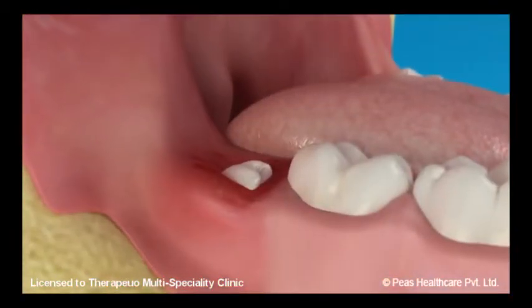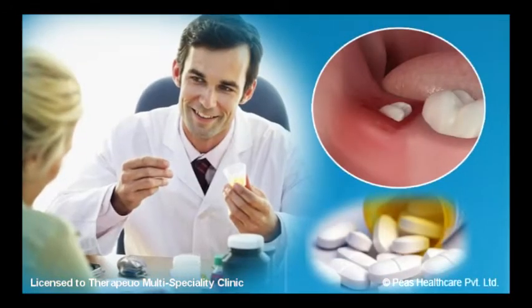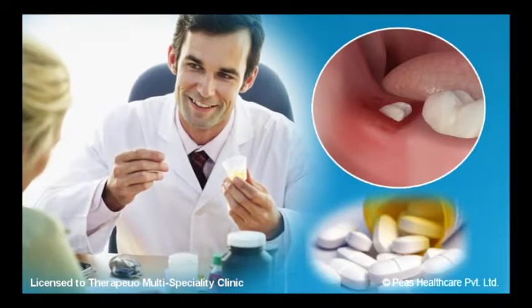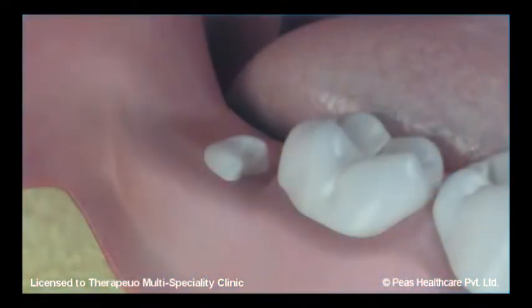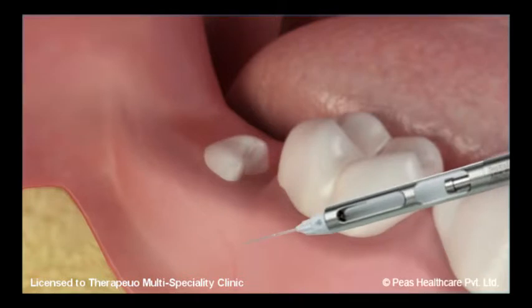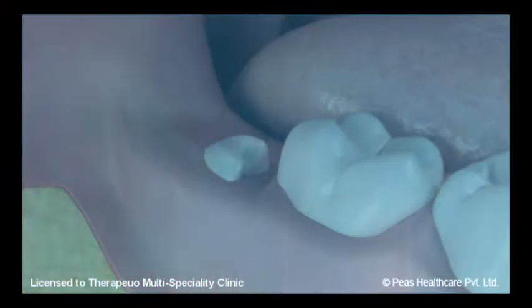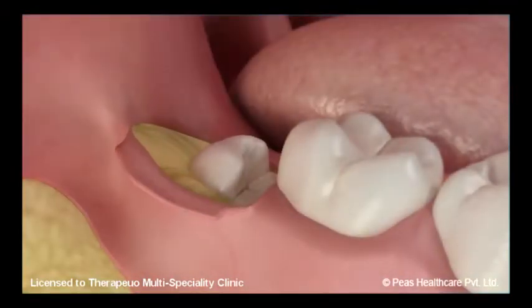In cases where the tooth is infected, your dentist may prescribe antibiotics 3 to 5 days prior to tooth removal. On the day of extraction, you will be injected with local anesthesia to numb the area. The dentist then makes an incision on the gums to open up the area in order to be able to visualize the tooth completely.